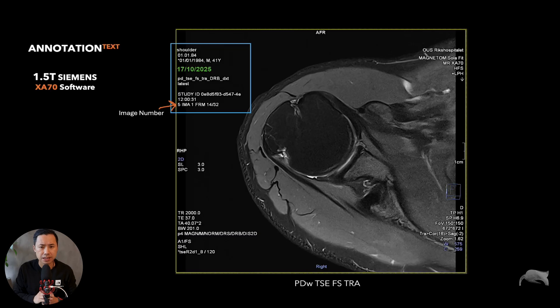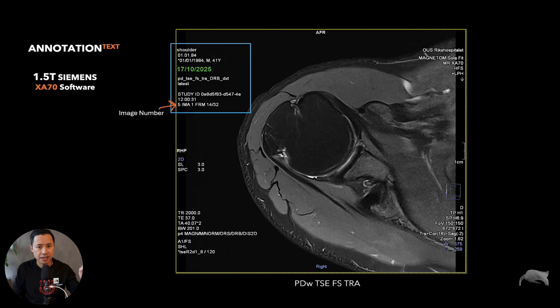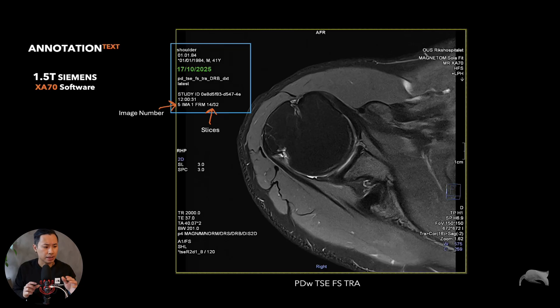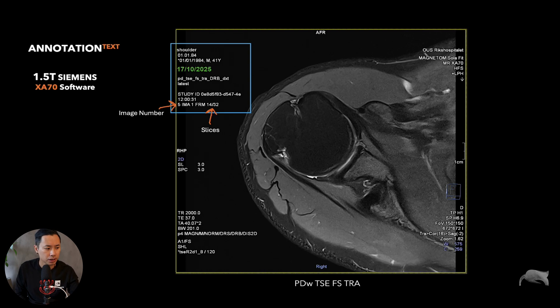Let's look at image number - here it says image number five. That means that in your protocol or for this patient you have already done five scans. Localizer is one; if you need one more localizer it will be number two, a third one is number three, maybe you start with your coronal as number four, and this one is number five. And this shows the slices - in this scan I have 32 slices, and the one you're looking at is number 14.